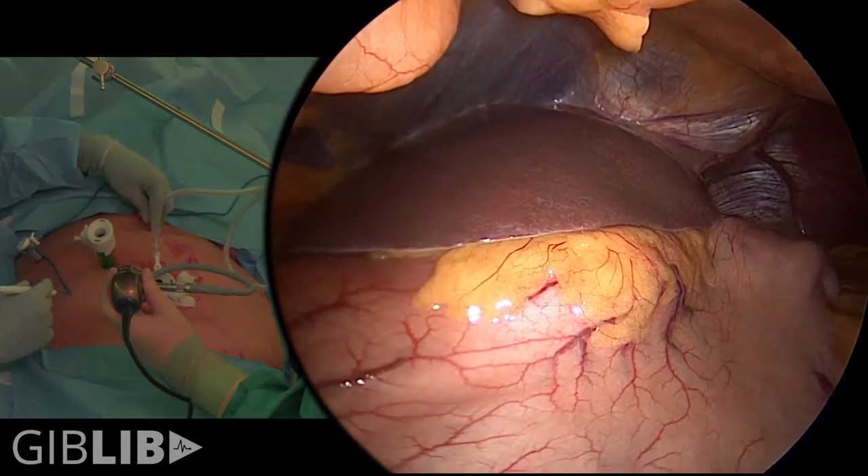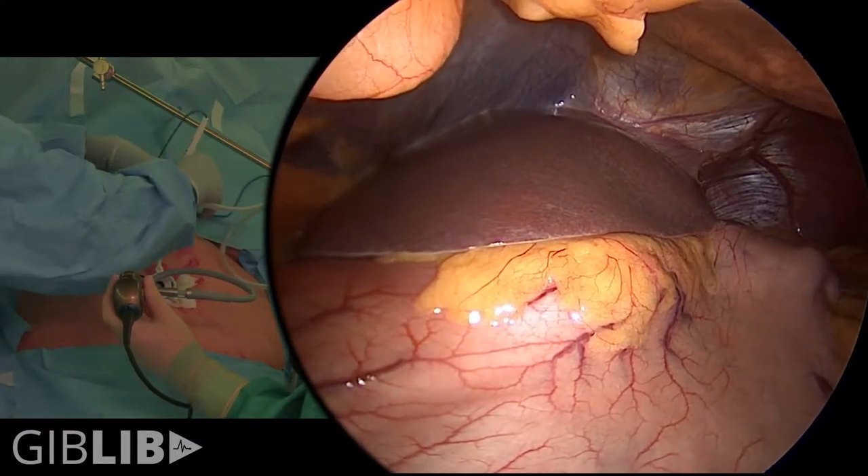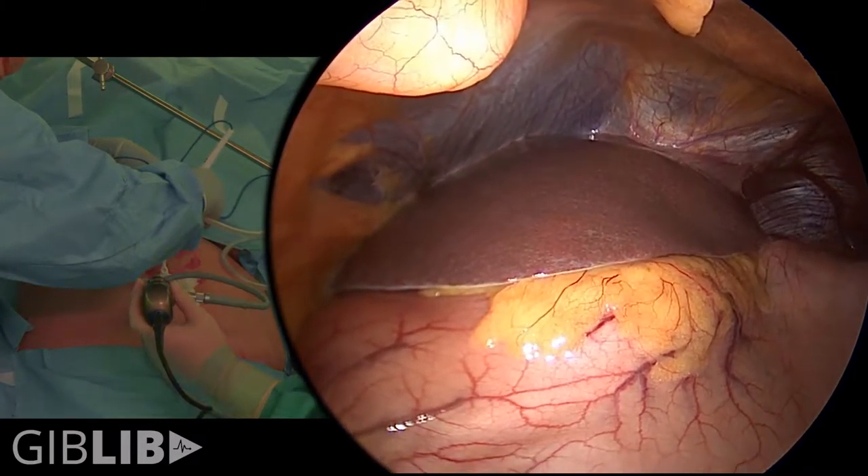This patient has a nice small liver, which is not usually the case for patients with obesity.